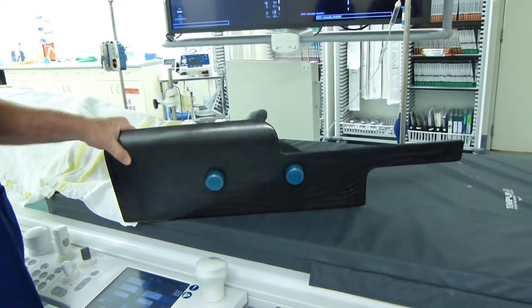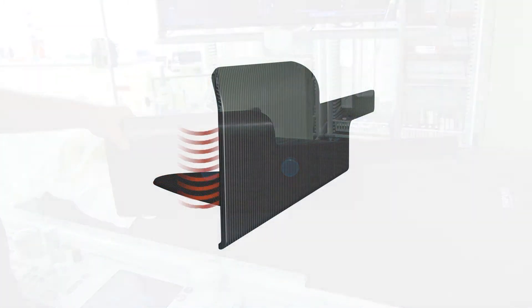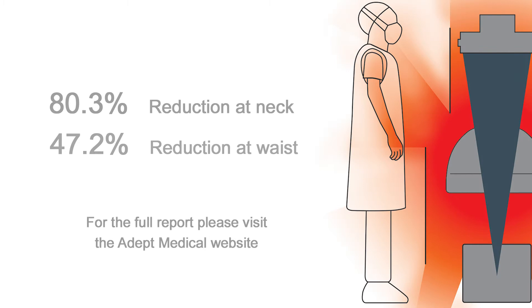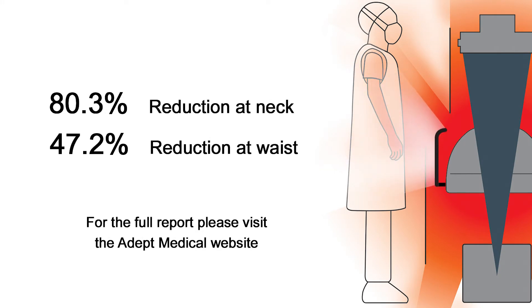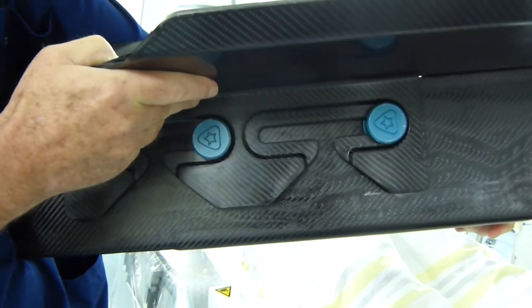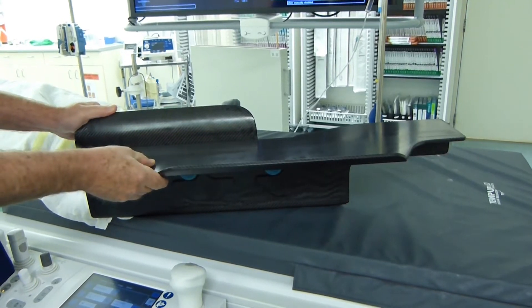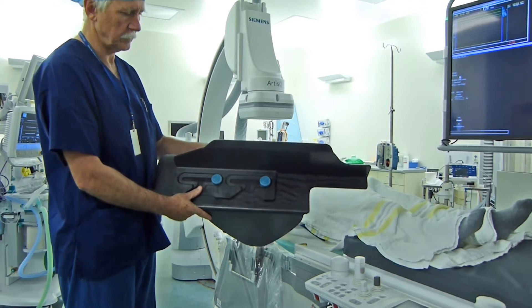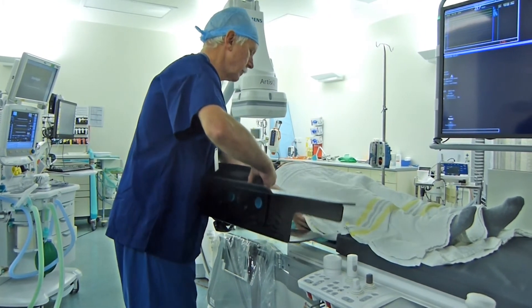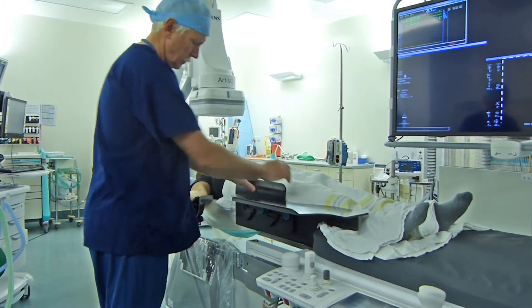This is the star table. As you can see, there's a portion that slides underneath the mattress, and then there's a vertical component that provides lead protection to reduce radiation exposure to the operator. There's also a table component that locks into the first component with an interlocking system and provides an adjustable table for the operator. The assembled star table is then placed underneath the mattress, in between the table top, and positioned appropriately.